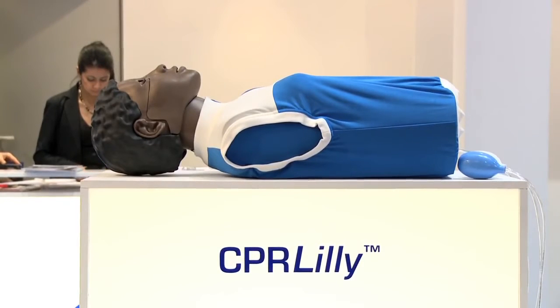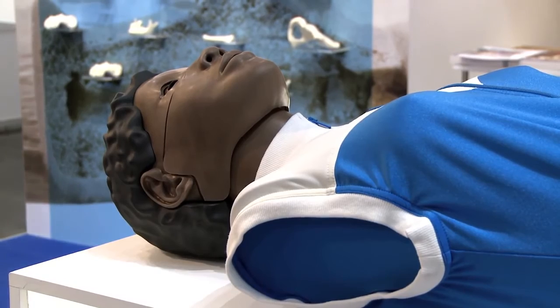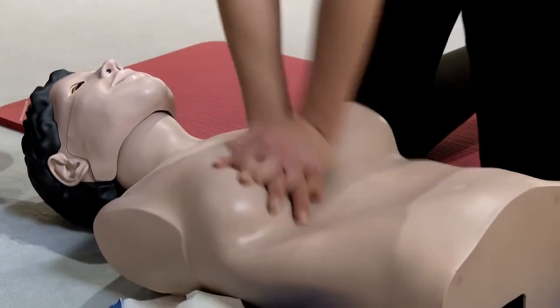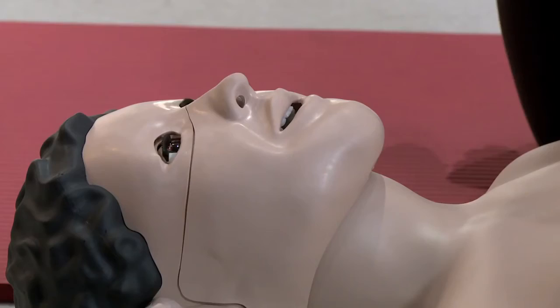The CPR Lily offers the same unique standards in quality and function. With the CPR Lily, the feedback of the correct compression is indicated with a click sound. Eye opening and carotid pulse can be simulated manually.